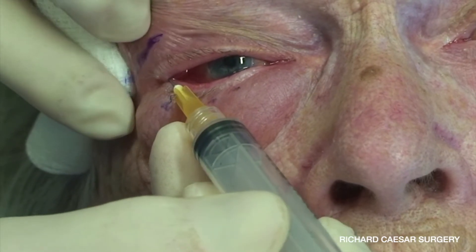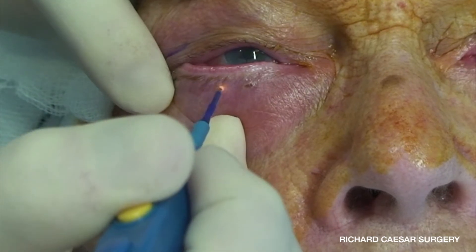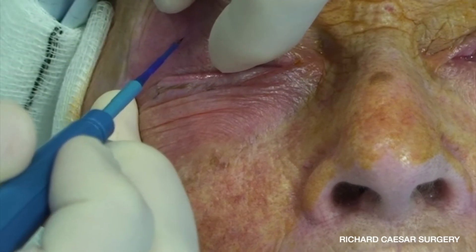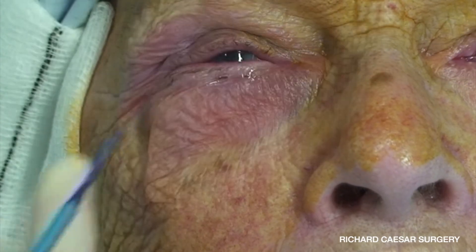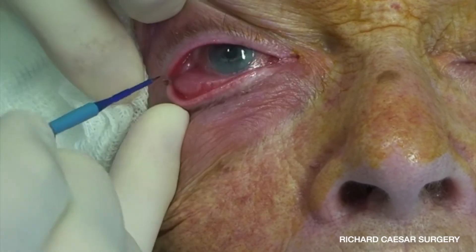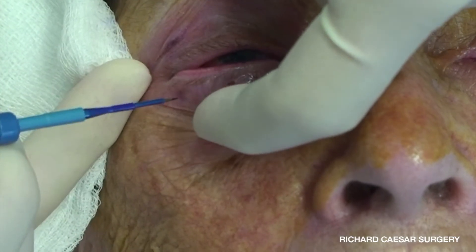Once completely anaesthetised, the next step is to create your incisions and start the dissection of the tarsal strip. I'm using a monopolar technique here which gives a very bloodless incision, but this isn't essential — this can obviously be done just as well with a number 15 blade and some bipolar cautery. When performing the tarsal strip with monopolar, you need your settings nice and low, mostly on cut, but it is a very speedy and elegant technique.